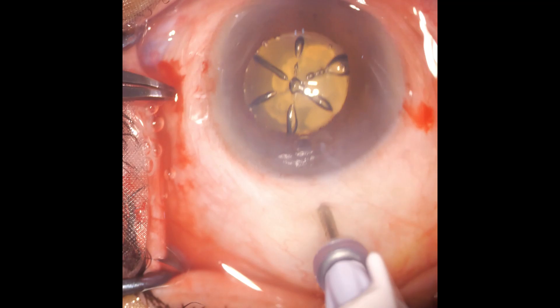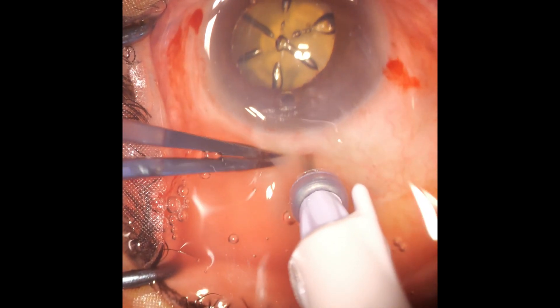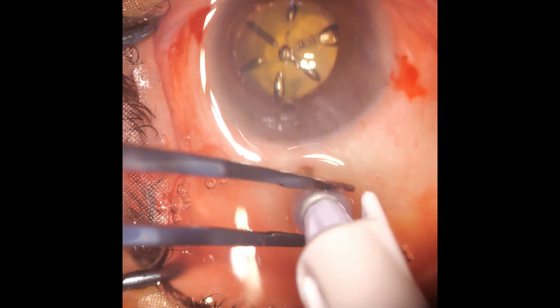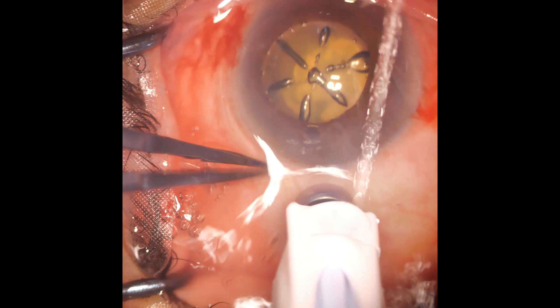Therefore one has to do a pars plana vitrectomy — put a trocar, get familiar with it, even though one is a cataract surgeon. It's very useful. The trocar is not fully inserted; now it is.